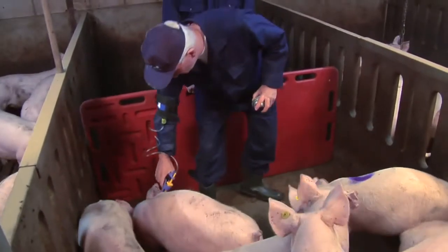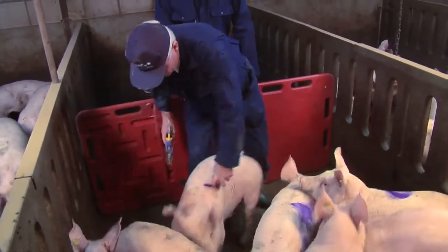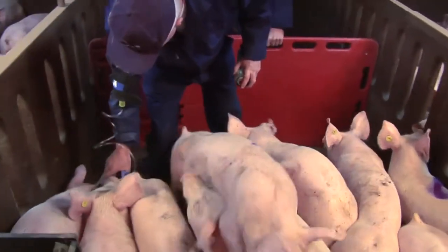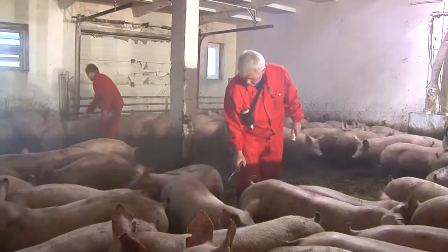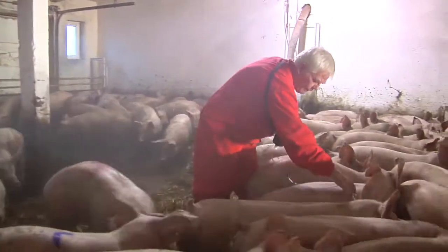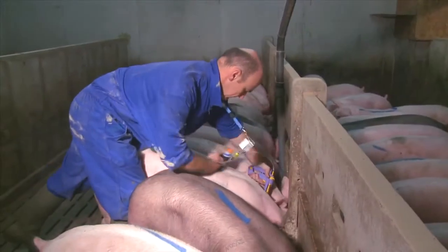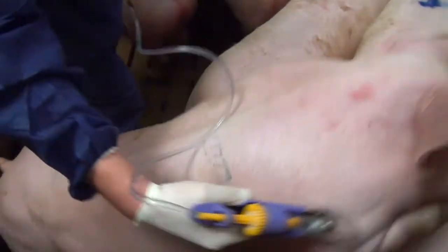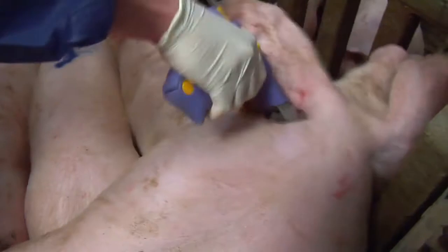Vaccination with Improvac is an efficient, animal-friendly and sustainable alternative to physical castration for the control of boar taint. Not surprisingly, it is being increasingly adopted by swine producers around the world. However, to reap the many benefits of Improvac, it is essential that it is used correctly and safely. This short presentation demonstrates the correct method for administering Improvac using an injector with enhanced safety features.